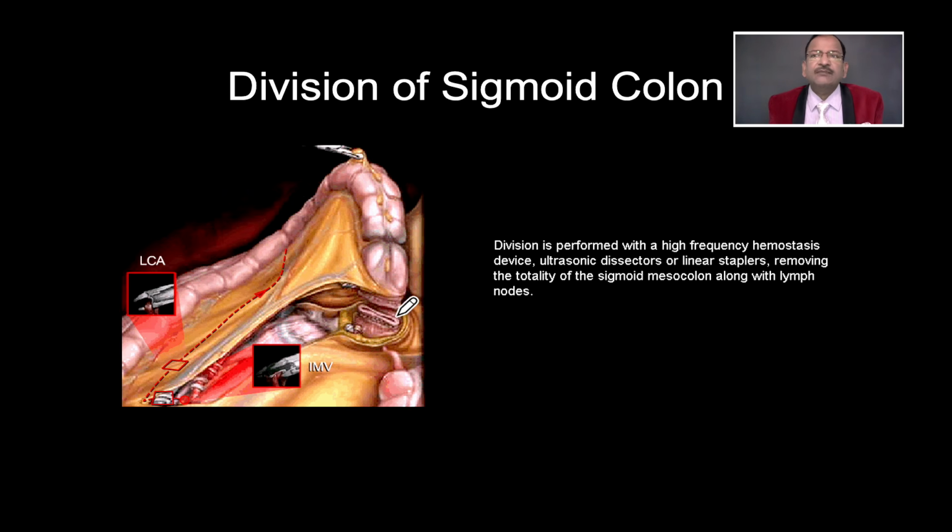So what is in the medial approach? Opening of the peritoneum over the sacral promontory, going anterior to the aorta, reaching up to the splenic flexure of the colon, then opening the peritoneum either side, trying to find the lymph nodes, then sparing the left colic, clipping the inferior mesenteric main branch, and then mobilizing the rectum, 5 centimeter distal, 10 centimeter proximal, and firing the endo-GI linear stapler. Up to this point is called the medial approach.